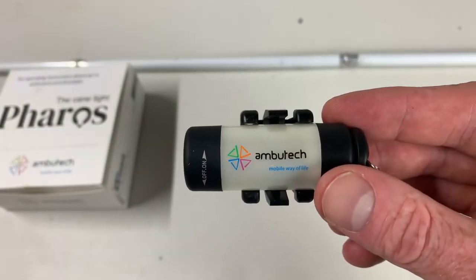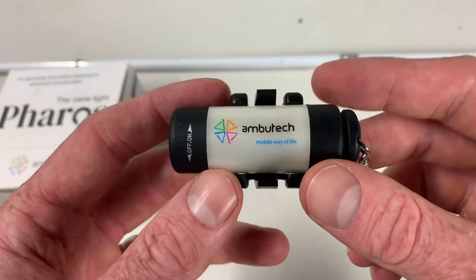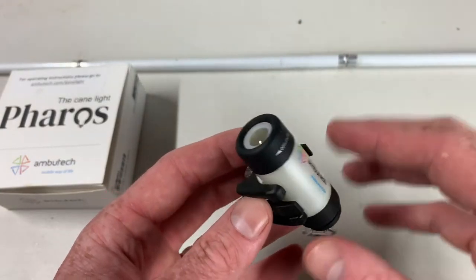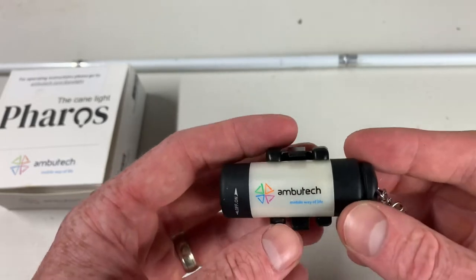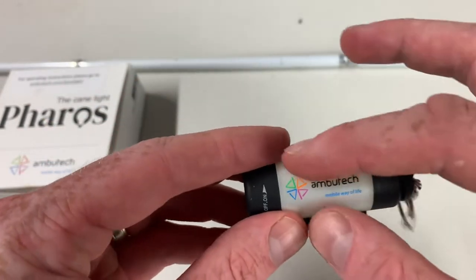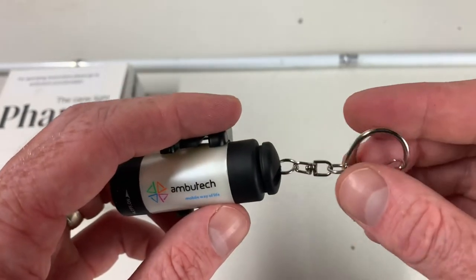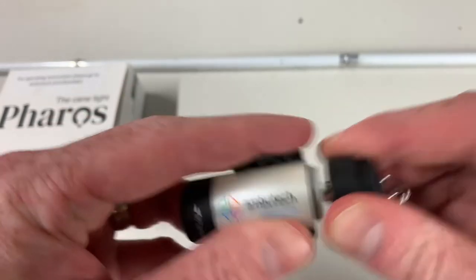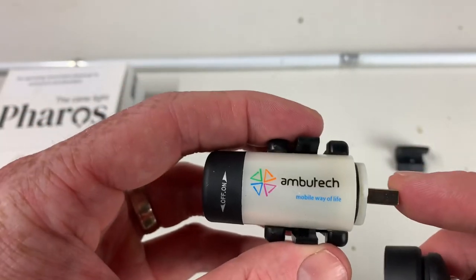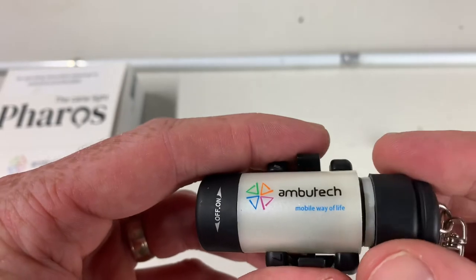Now I'm going to describe the Pharos Cane Light and how it works. I actually have it here in my hand. It's about the size of half a quarter roll, probably about the same width. It's pretty light. It is black at the end where the light shines out, and then a whitish color in the middle — it says Ambutech on there. There's a black end with a keychain ring, and underneath that is the USB port for charging. It's a rechargeable light — it takes about 45 minutes to charge and the battery life is about 45 minutes of constant use.